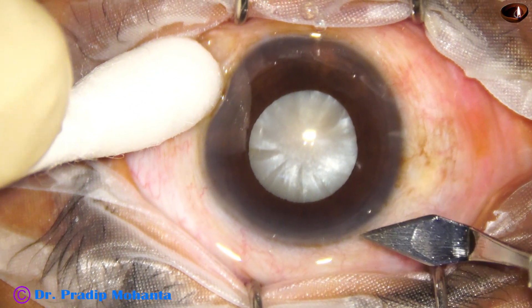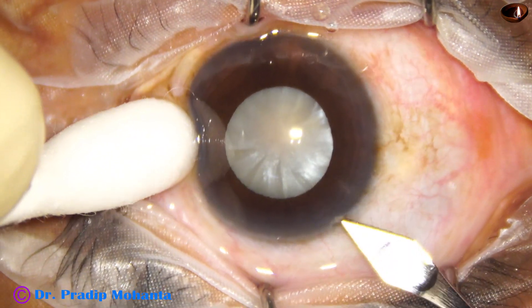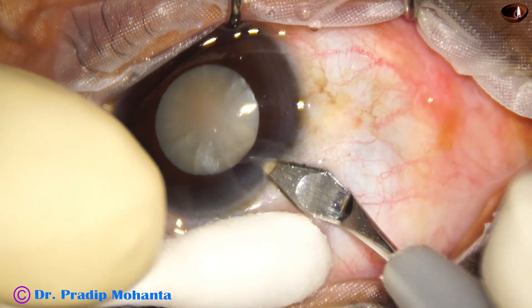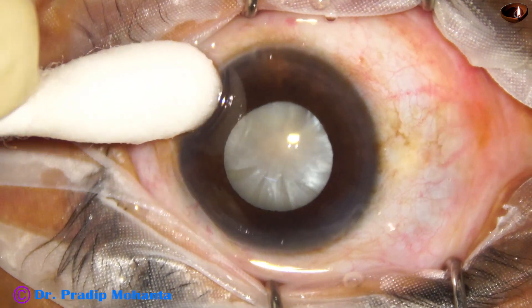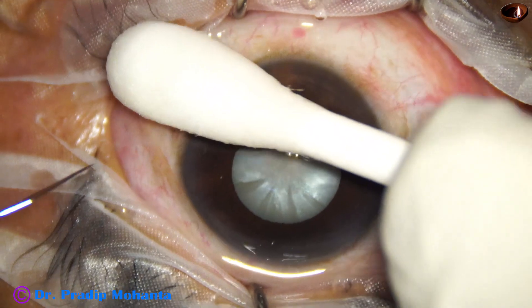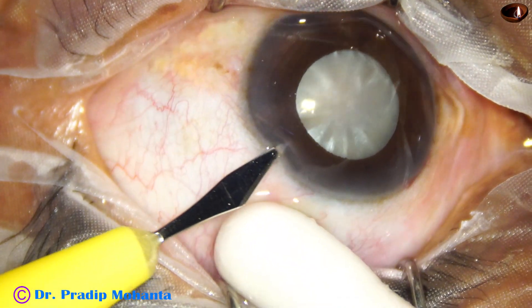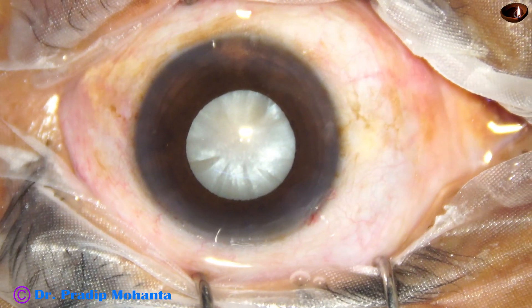Let us see how I managed these steps when intraoperative miosis occurred. This is the main incision with a 2.8 mm steel keratome. This is a slow surgery; it will take about 12 minutes, so please take some time to watch. This is a side port on the left side of the main incision.